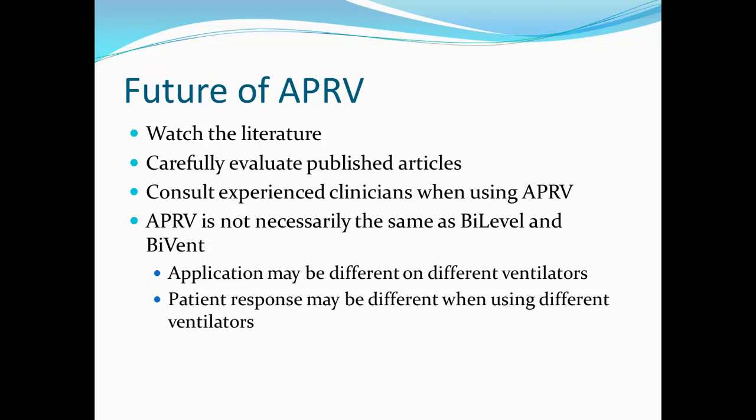I think that many of us are very familiar with volume AC, pressure AC, PRVC AC, CPAP, pressure support, etc. And a lot of ventilation is rather intuitive. However, to me at least, ventilating patients with APRV is not something that's intuitive. It's something that I've spent a lot of time talking to people, talking to experts, working with it clinically, and spent a lot of time reading about it. And I really think that if you're going to start using it, you need to have someone that you can talk to and consult about the patients.